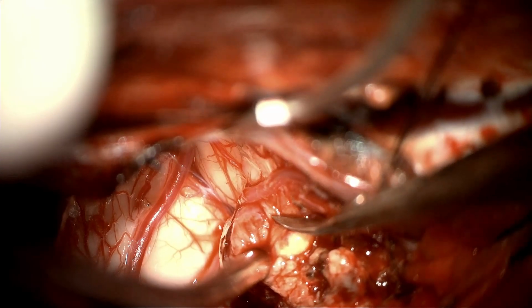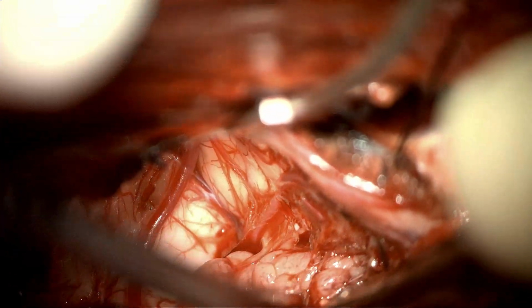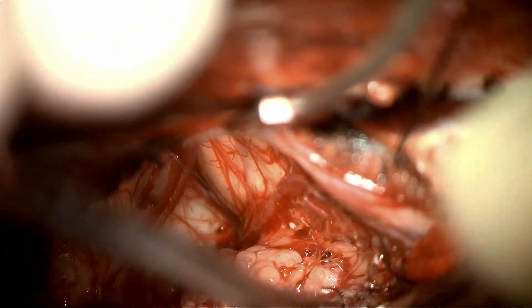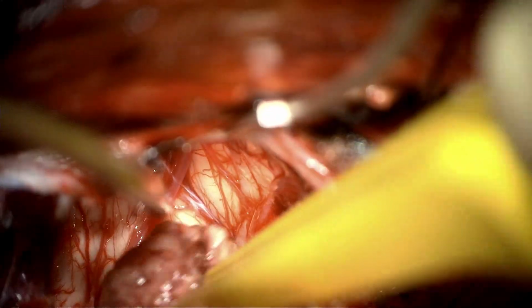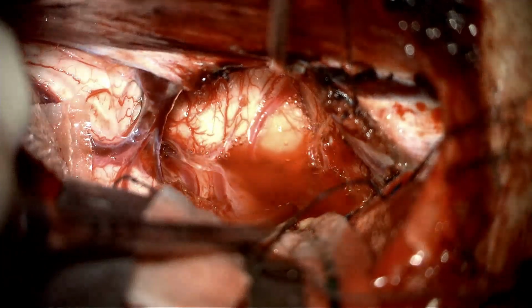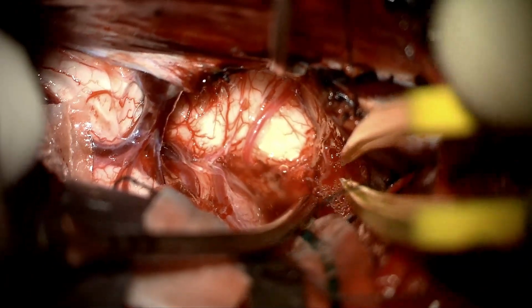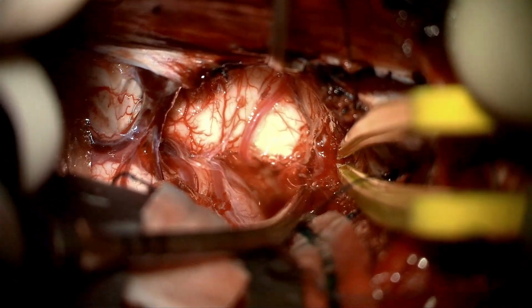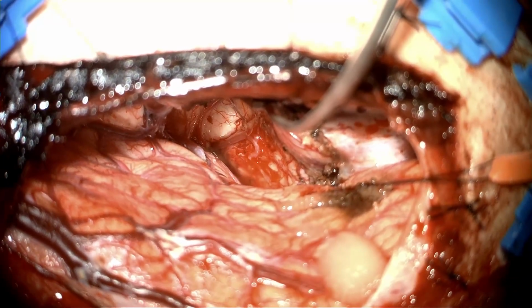And we are still dealing with this last portion of the tumor that was attached, the posterior margin of it, to the cerebellum, and we just need to rotate. And as you can see, the falx and the tentorium act as countertraction. Finally, we were able to achieve gross total resection. It's just some warm irrigation needed to achieve hemostasis.